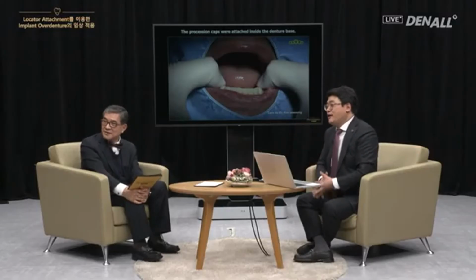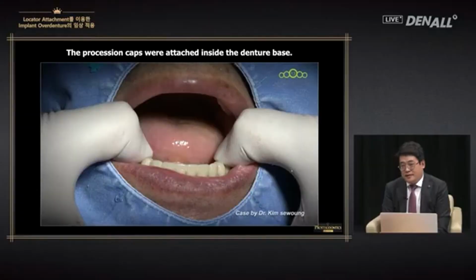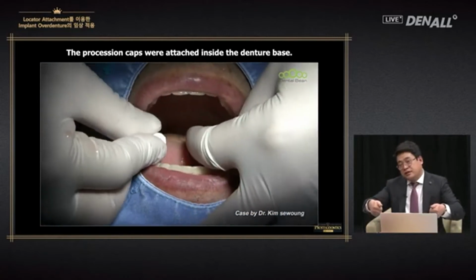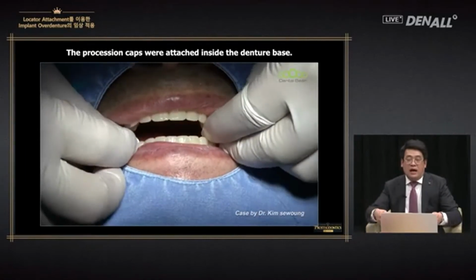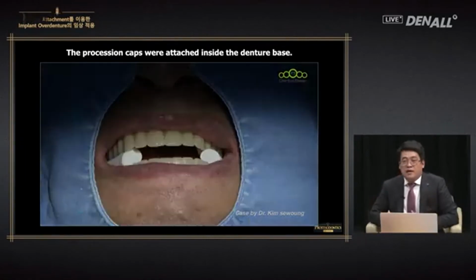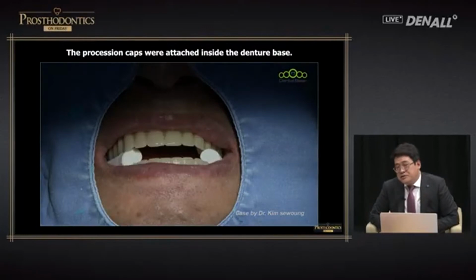When you use rebase resin, I gave you a tip providing undercut. You can prevent it from falling out. After you cement it, what are you going to do? Are you going to press it with your hands or are you going to have the patient bite? I'm sure you would be torn between the 2 options. Personally, I recommend you to press it with your own hands.